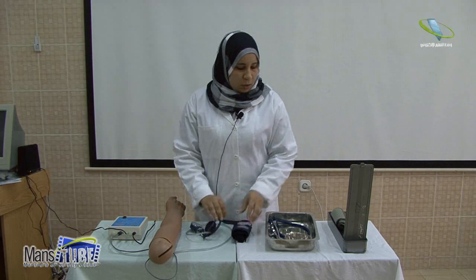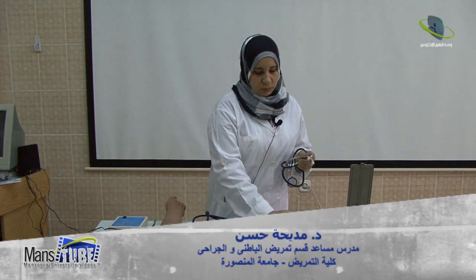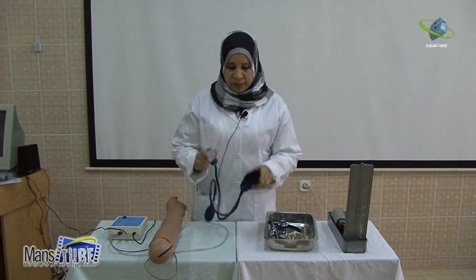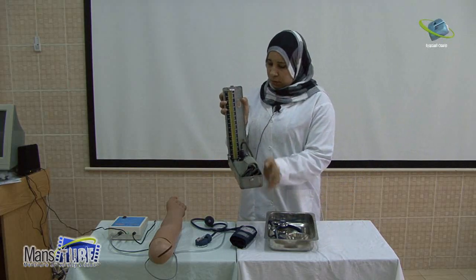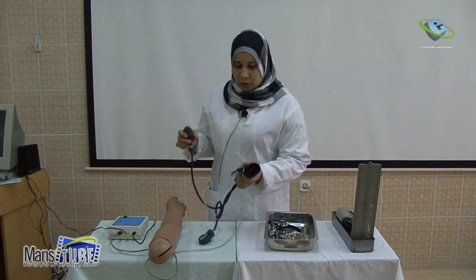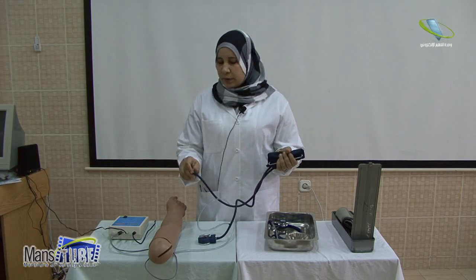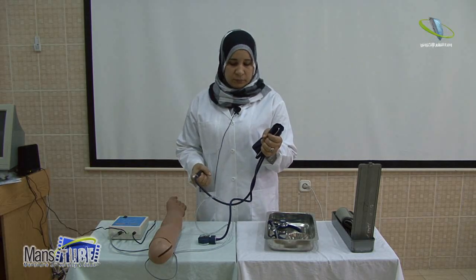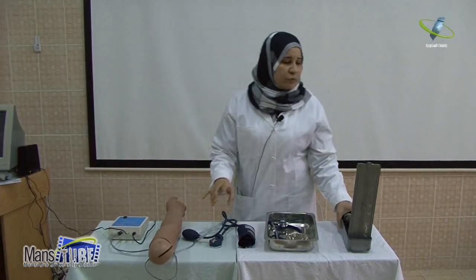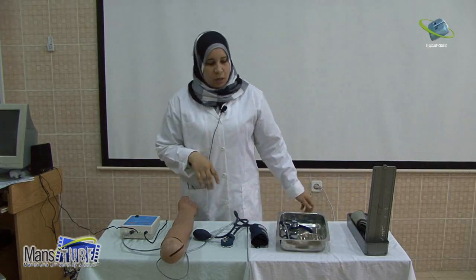To measure blood pressure, we need a sphygmomanometer, stethoscope, kidney bowl, and alcohol sponge. We have many types of sphygmomanometer: the aneroid type, mercury type, and electronic type. We should check the efficiency of the equipment before going to the bedside by applying pressure to the cuff, closing the valve, and inflating it. The mercury moving up in the tube ensures the apparatus is functioning.